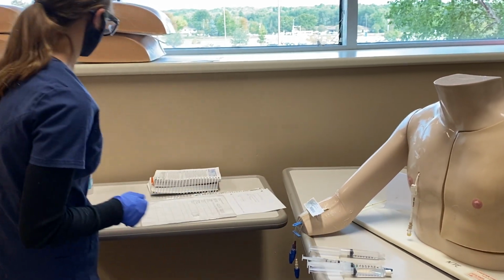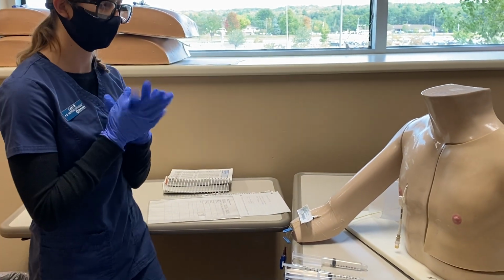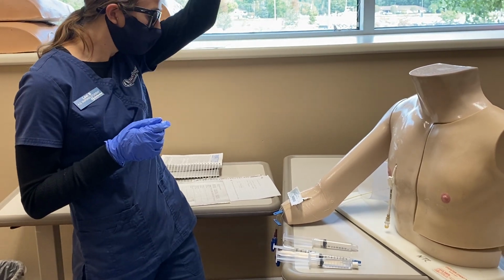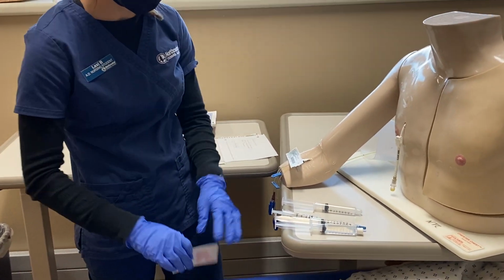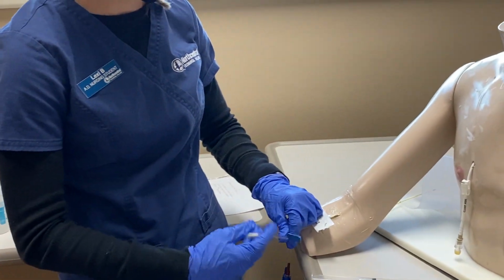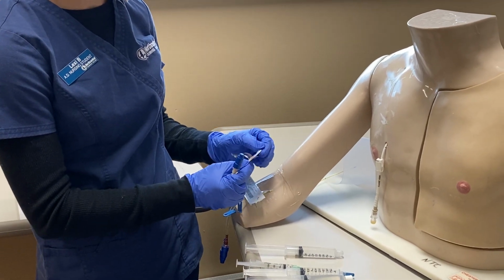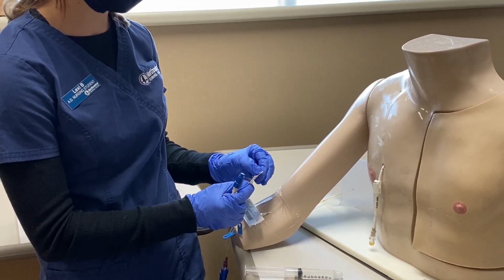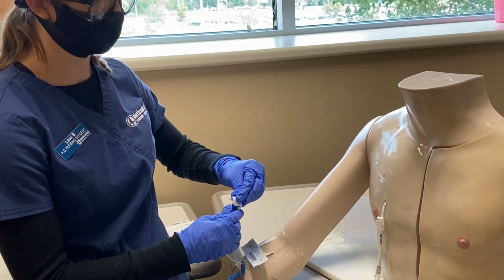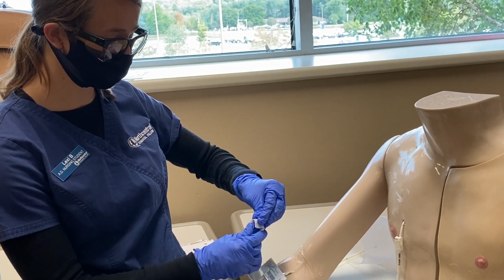Alright, so I'm just going to wash my hands. Sometimes I touch them all. If anything, I could just put on new gloves. Alrighty, so I'm going to go ahead and open the clamp and cleanse it. My facility's policy allows for using alcohol wipes, and we can do it for 15 to 30 seconds. This may differ depending on your agency.